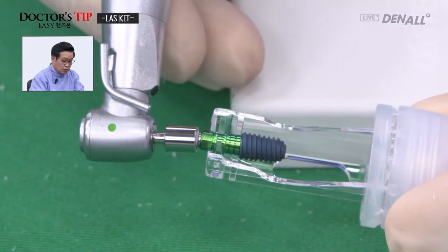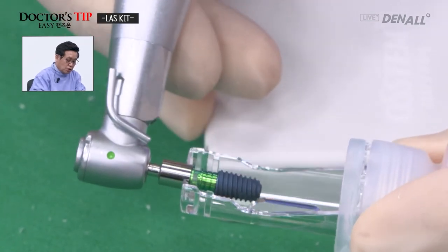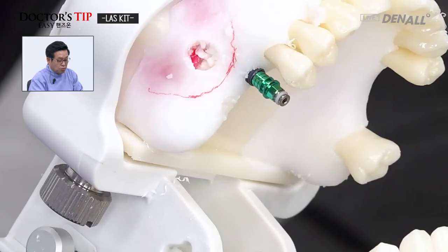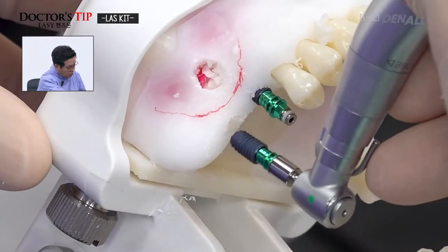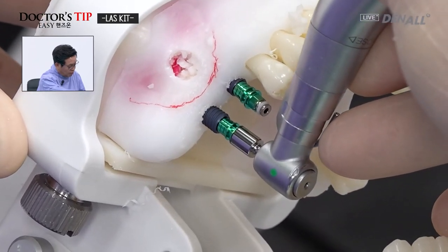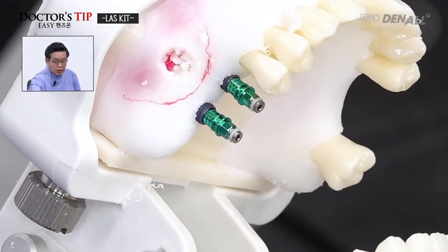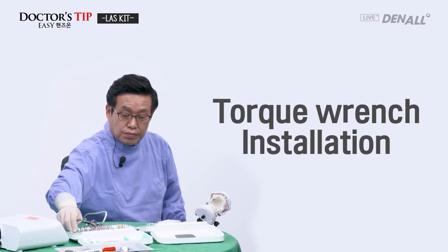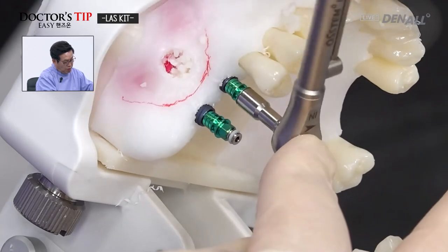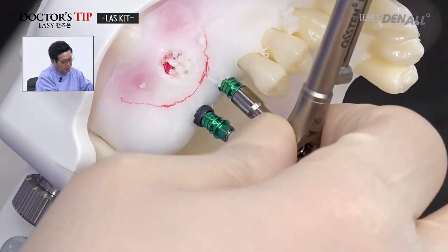Next, TS3 diameter 5.0, length 8.5 implant fixture, with the pre-mount, you check again that it's in the right mode, and then place the implant. And if it's placed, then using the hand wrench, the implant will be placed to the final depth.